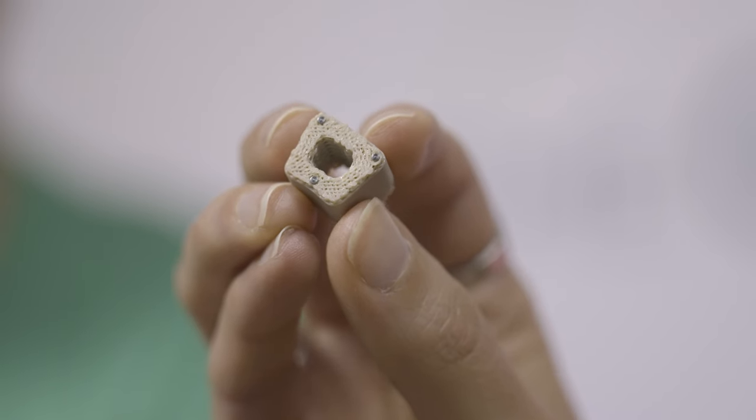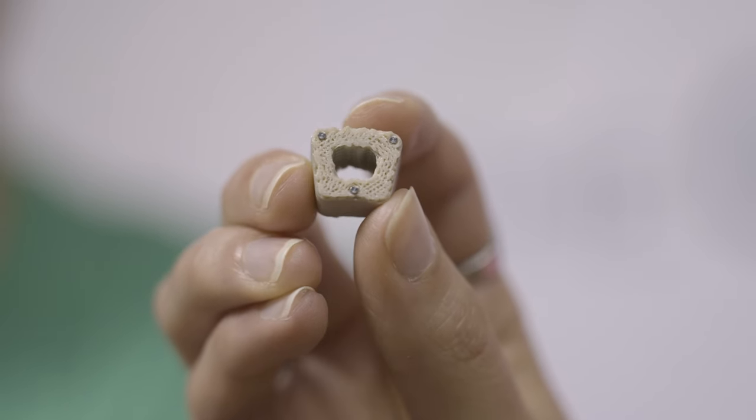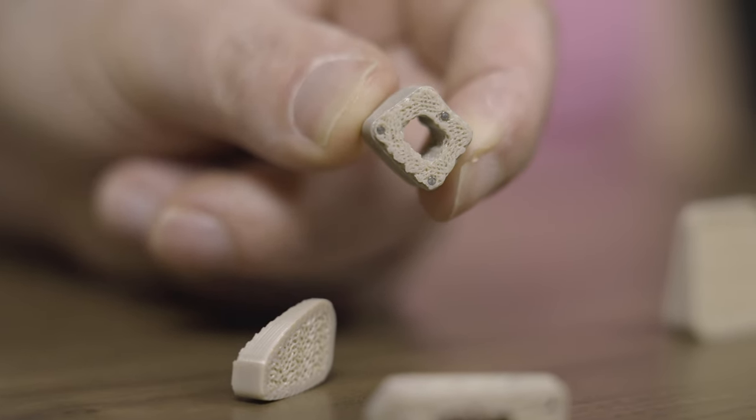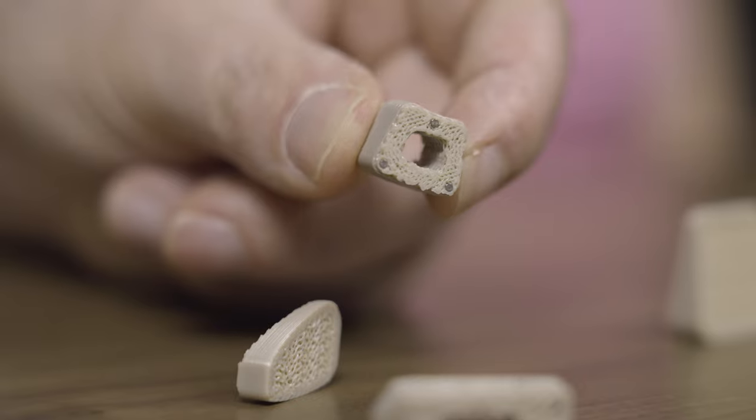Without controlling some of the thermal history when printing PEEK, the PEEK can be locked in this amorphous state, and that'll create this amber to translucent brown streaking within the layers, and also minimizes the mechanical strength on your Z layer bond. And so a semi-crystalline state will be the natural opaque off-white color, which you'll see consistently through the construct in a finished printed device. So the specific 3D printing method that they're using is called fused strand deposition.